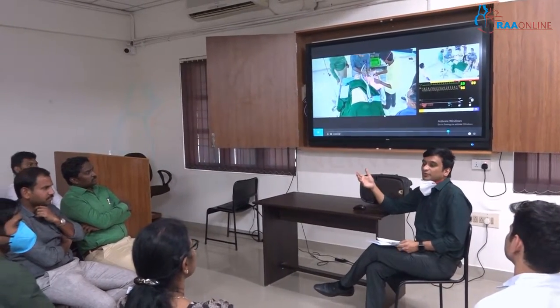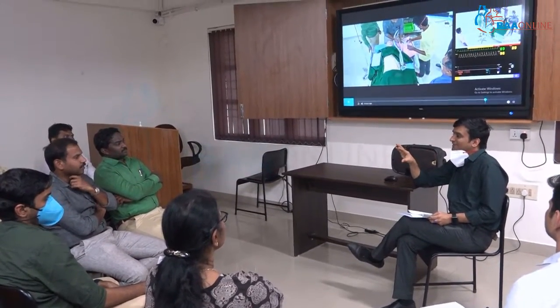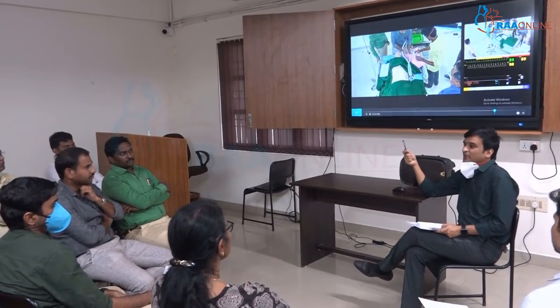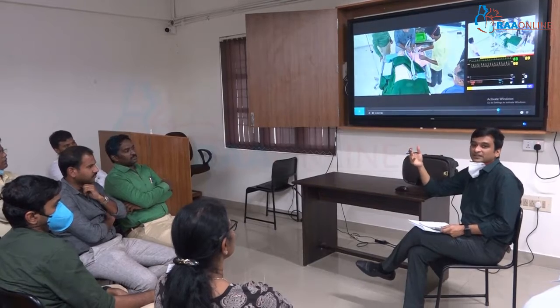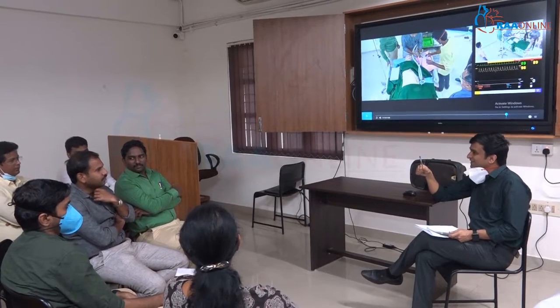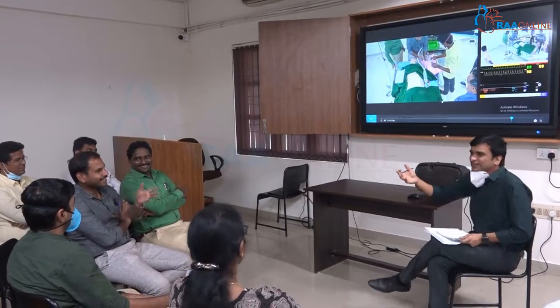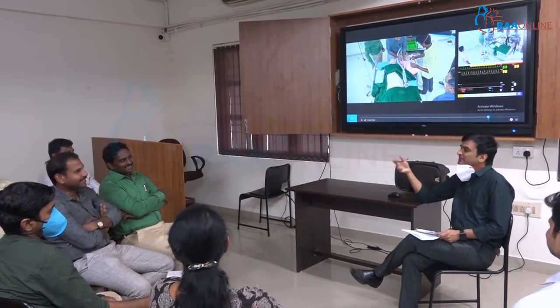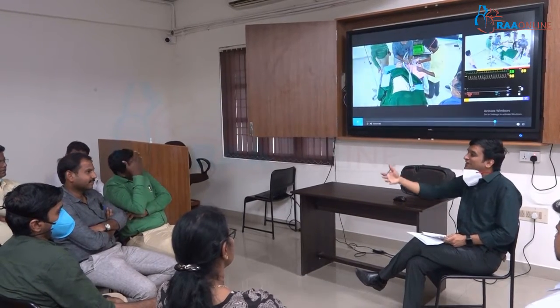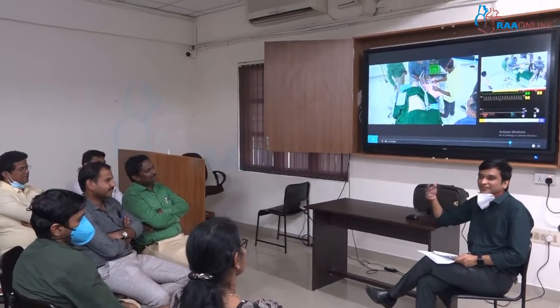So what are we trying to provide to the patient? In between, actually the oxygen flows were not on. Usually we have to ensure that. In fact, in between he went and you switched on the oxygen. Did you realize that? Yes. I thought I will leave the machine part. Okay, that's fair enough. Actually, sometimes we presume that part. But by reflex, probably he went and switched on the oxygen. Sometimes some things get imbibed in our practice.